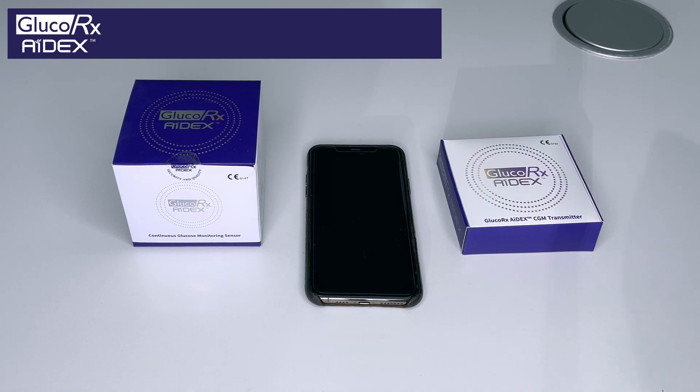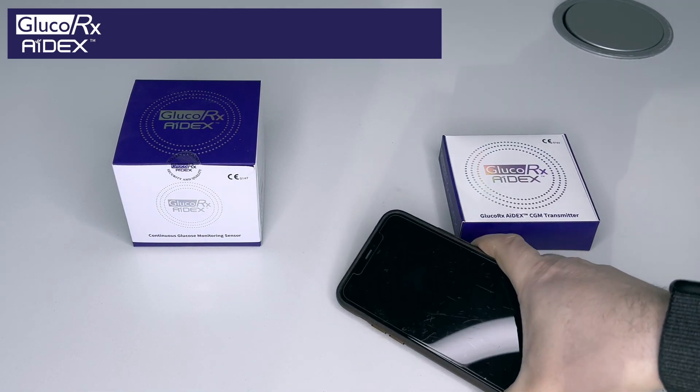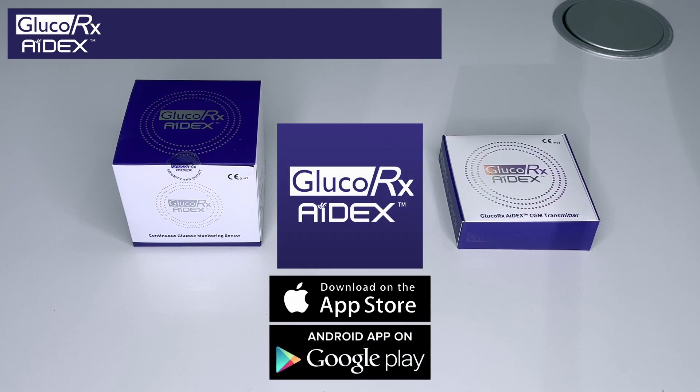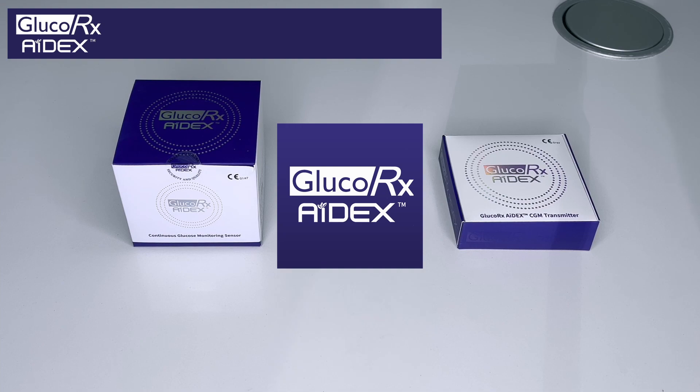So how does it all work? First things first, on your smartphone you need to go into the App Store or into the Google Play Store and search for GlucoRx AiDEX — that is GlucoRx and then AiDEX. Once you find that from the store, really simple, download it as you would do normally.